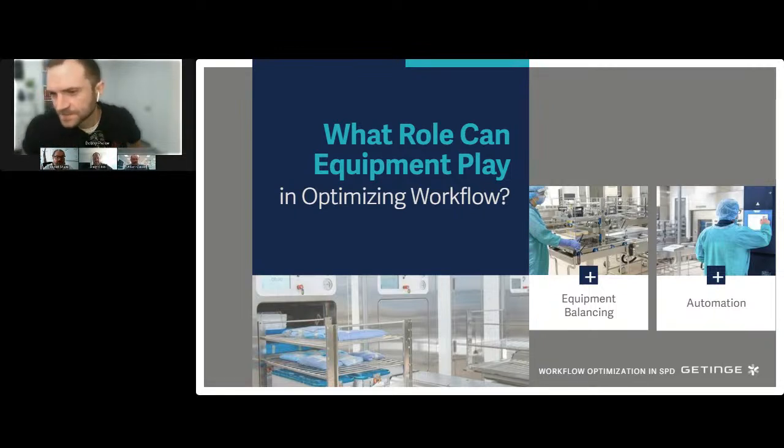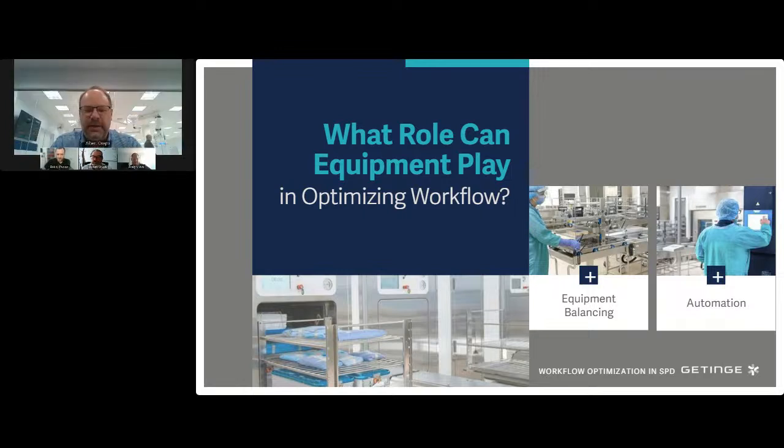Yeah, sorry, it's Albert. One thing I'd like to add, one thing I look at when purchasing equipment is redundancy. It's so important. If I know I need 4 instrument washers, I'm going to see if I can get a 5th washer in there for times when they're down for preventive maintenance or repair, or ensure that my cart washer has an instrument cycle, so that if my instrument washer were to go down, it has capacity to continue the workflow.